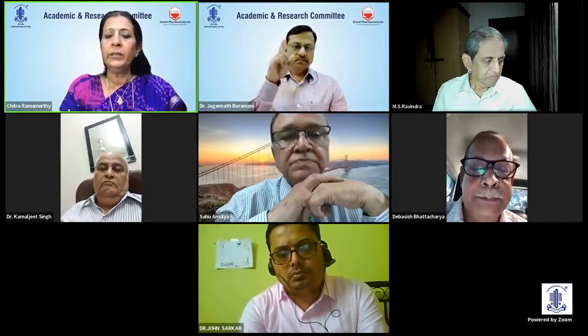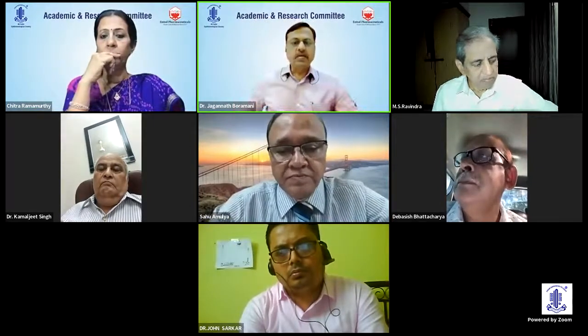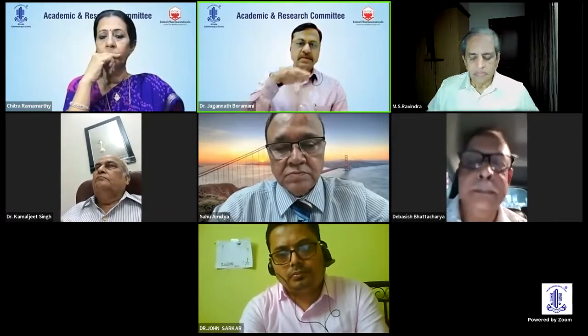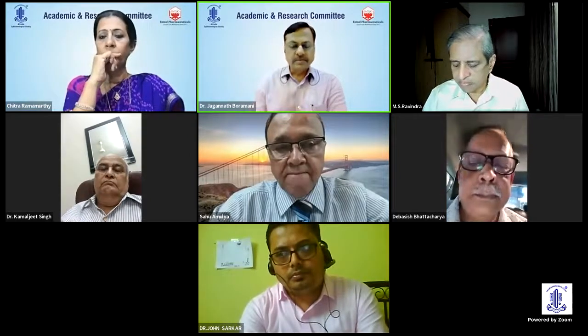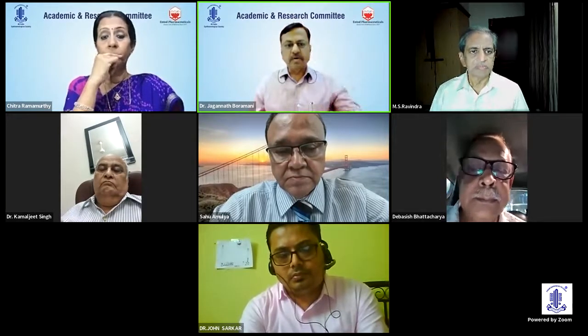Yes, Dr. Boramani. I have a few comments. As Dr. Devashish rightly said, for the dissection, you have to keep the curvature of the globe in mind. Many times a beginner just keeps moving the blade in a horizontal fashion, but you have to go in a curved fashion, and nasally the globe is more curved, so you have to always keep it in mind.